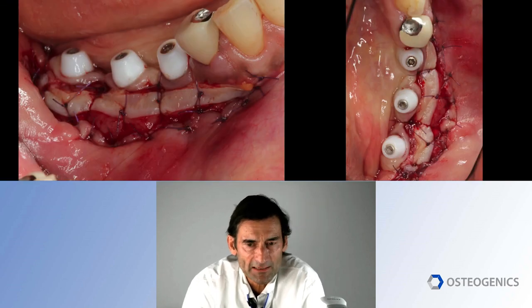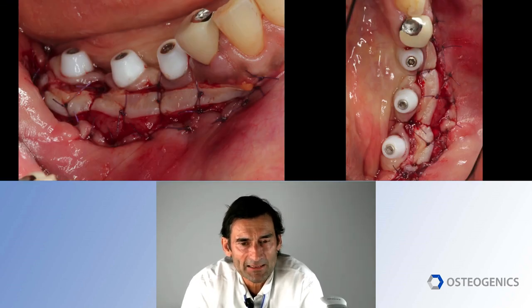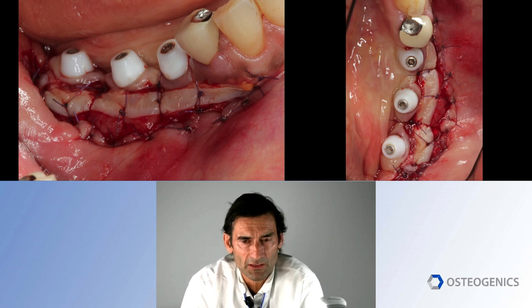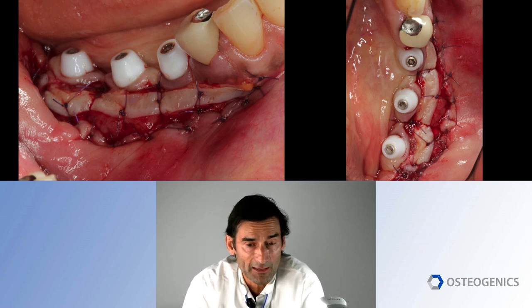Then the next step is placing the gingival graft that I harvested from the palate. This is a strip gingival graft, as it was published and documented by Dr. Henry Takei from UCLA many years ago. It's a beautiful graft, with very minimal trauma to the patient and a big effect on increasing keratinized gingiva. So you can see how I'm using that. And again here, my go-to suture, because it's mucogingival surgery, is a resorbable suture. So again here, I'm using a Glycolon.